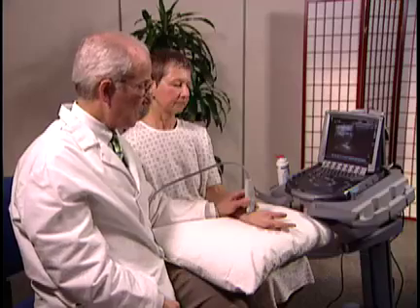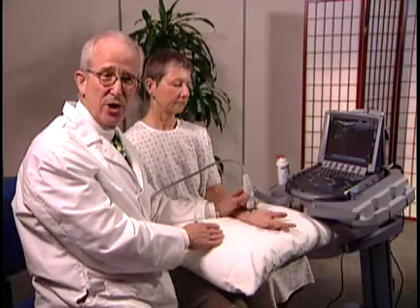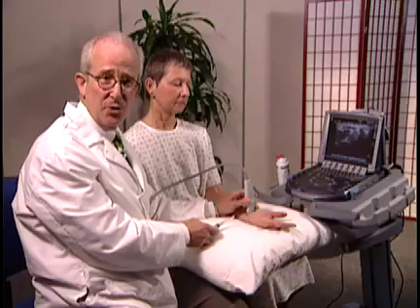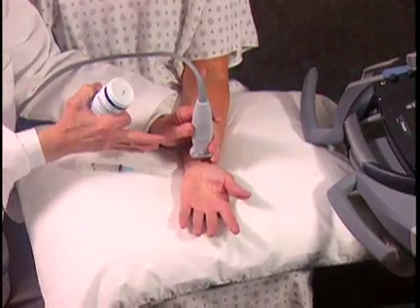This is a demonstration only for injecting the median nerve, placing steroids into the carpal tunnel, so I'm not using sterile technique, sterile gel, or cleansing the area. This is for demonstration purposes only. And I'm going to be doing an injection in this direction.